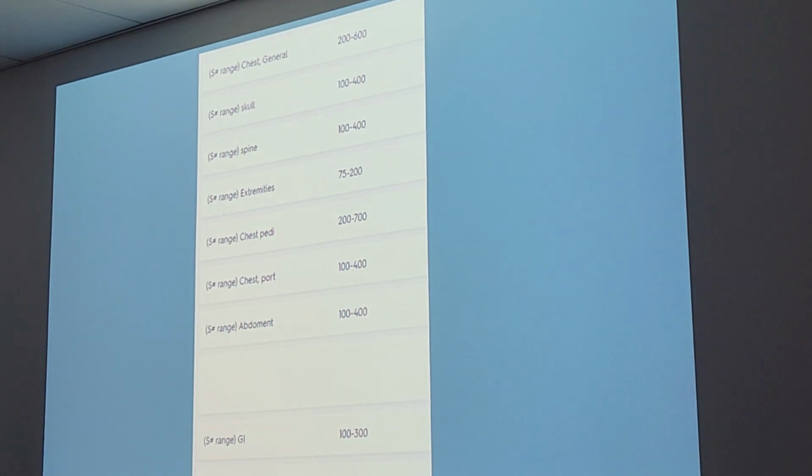Just a really quick question, some of these images were acceptable, right? And those were the exact same images that you gave us on the sheet of paper yesterday? Yeah, these were the exact same. So we're not worried about the marker, right? Because I put unacceptable for all of them, because I saw the digital marker. That's what Mr. Donahue keeps harping on, you see the marker, that's it, throw it out. Well, this is my class.